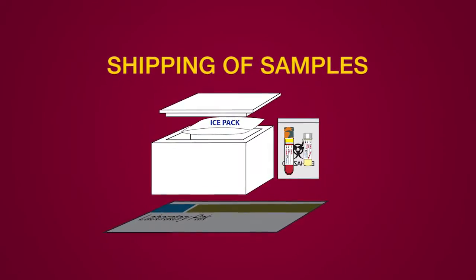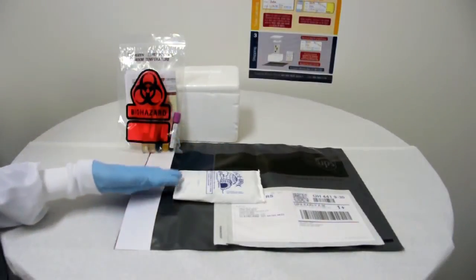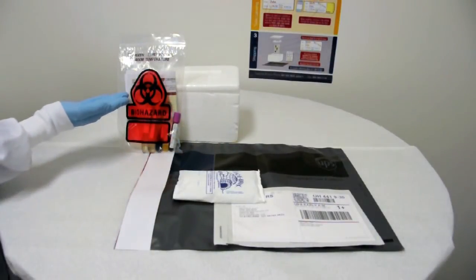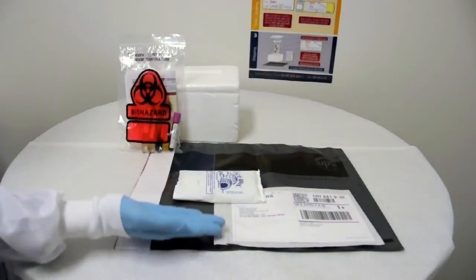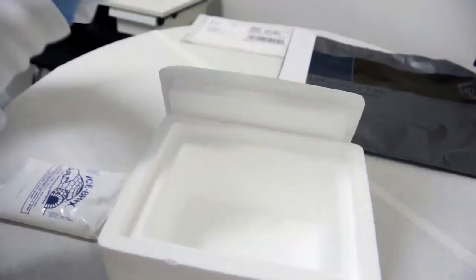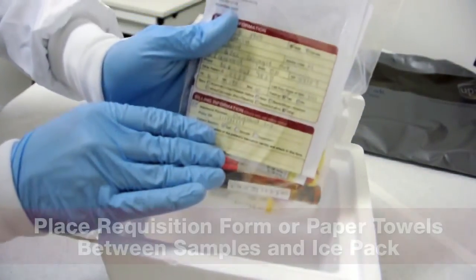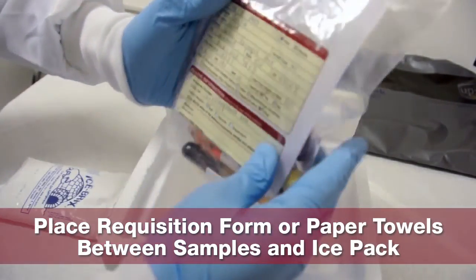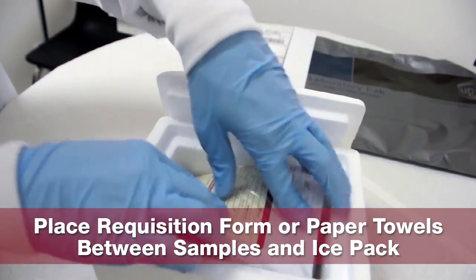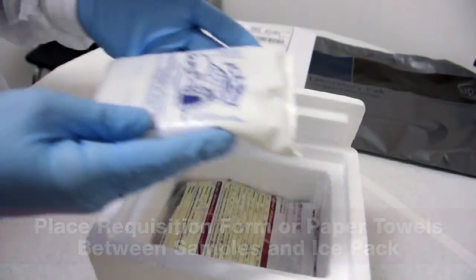Shipping. Cleveland HeartLab will provide all the necessary materials to ship samples. The materials include a styrofoam box, ice pack, biohazard bag, tube labels, a UPS shipping bag, and a prepaid UPS shipping label. When ready to ship the samples to Cleveland HeartLab, place the biohazard bag filled with tubes into the styrofoam box. Please place a protective barrier such as the requisition form or paper towels between patient samples and the frozen ice packs to protect the integrity of the whole blood samples.